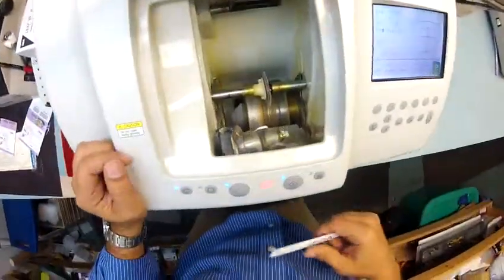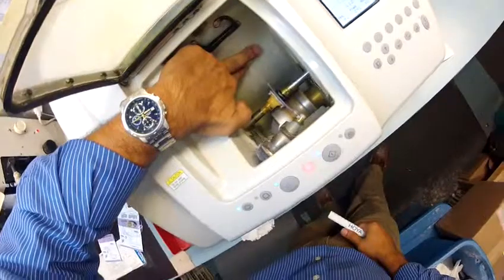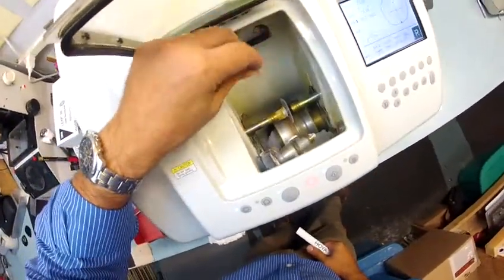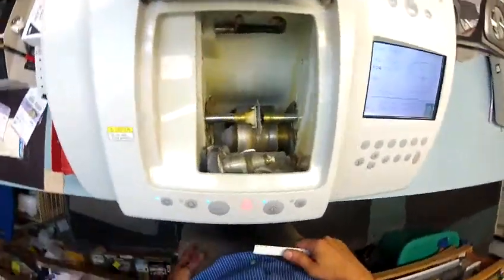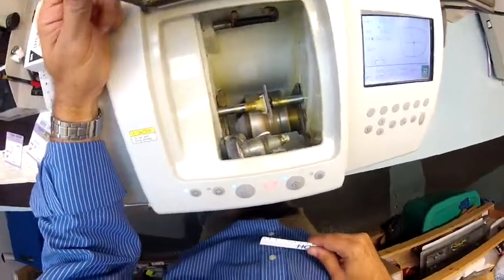You can always cut more off of a lens. You can never add it back on. And if you notice, there is water running in the background, but polycarb cuts dry where plastic and high index lenses cut wet. So these are the unbreakable bulletproof lenses, so they don't need water while they are cutting.